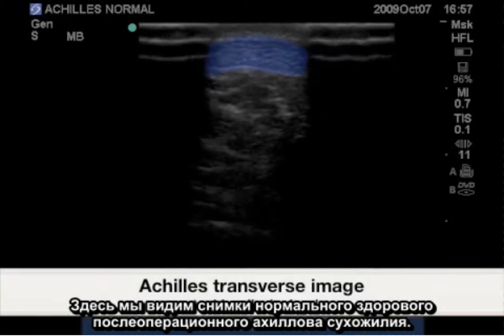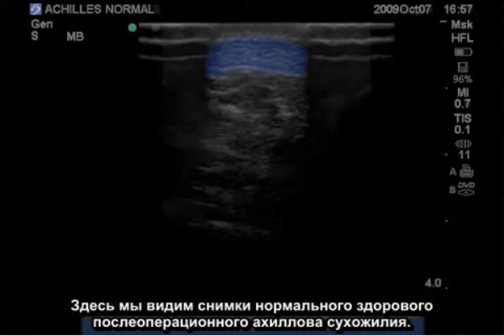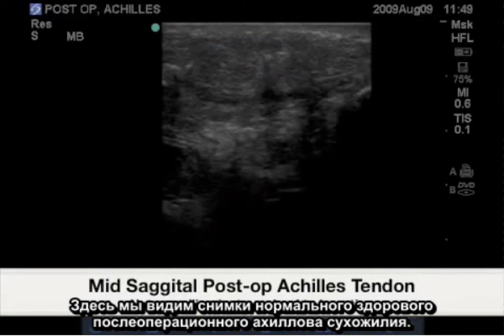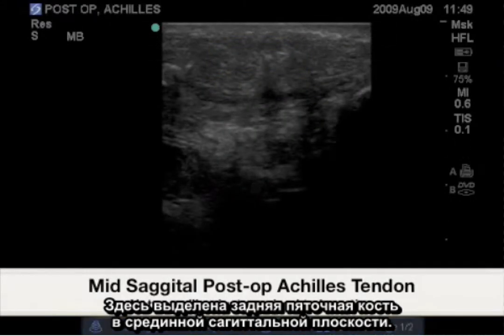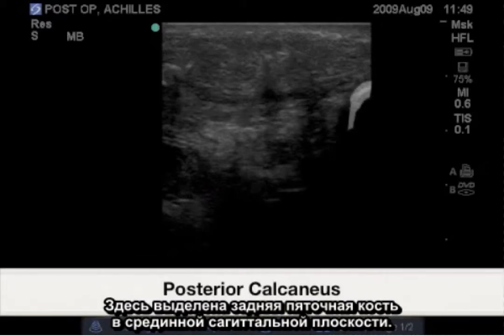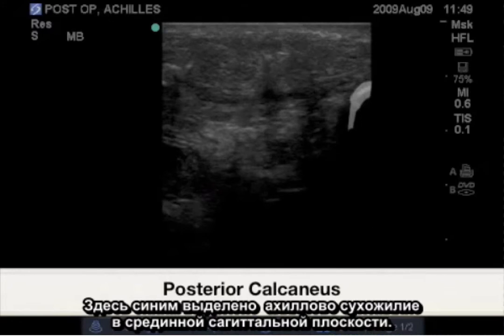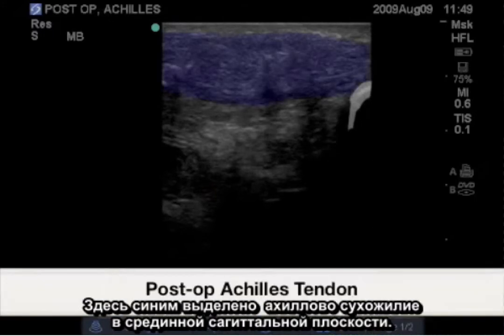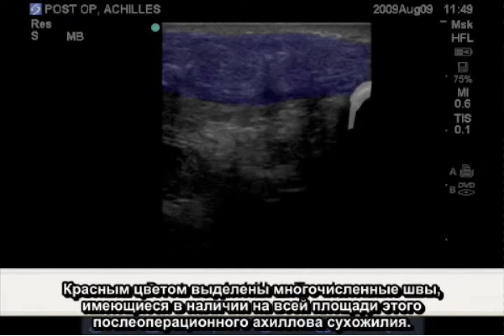Here we will see images of the normal intact post-operative Achilles tendon. Highlighted here is the posterior calcaneus in the mid-sagittal plane. Highlighted in blue is the mid-sagittal Achilles tendon. Highlighted in red are the multiple sutures present throughout this post-operative Achilles tendon.